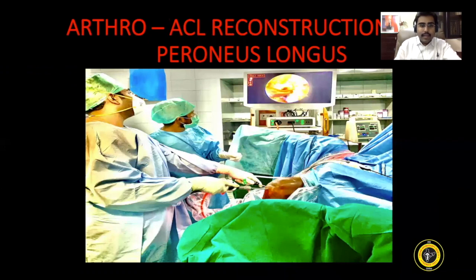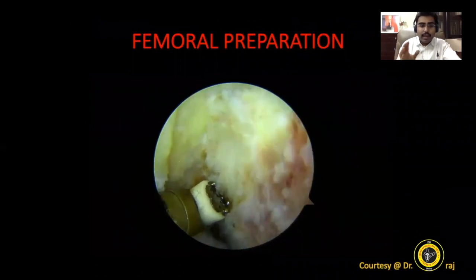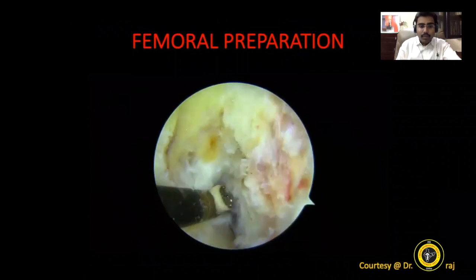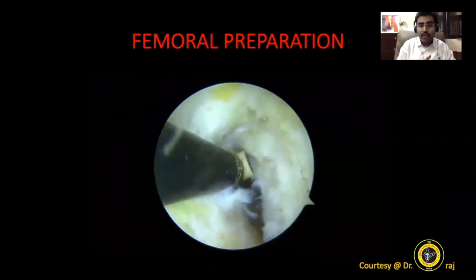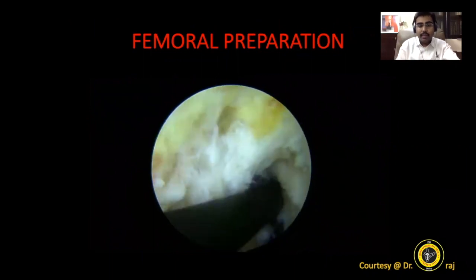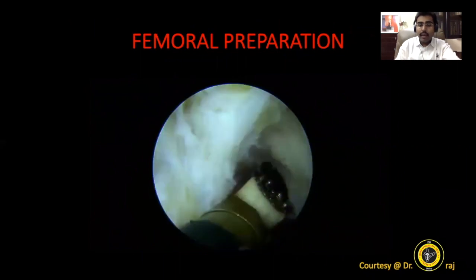Now, once that is done, I'll quickly run you across the arthroscopic video of how I do the ACL using the Peroneus longus. It's no different than the normal ACL. Now, this is the kind of view I love having on my viewing portal, clearing off and skeletonizing the lateral wall of the intercondylar notch, giving me a clear view of the posterior and the anterior limits. I love following the skeletal landmarks of the bifurcate and the resident's ridge.